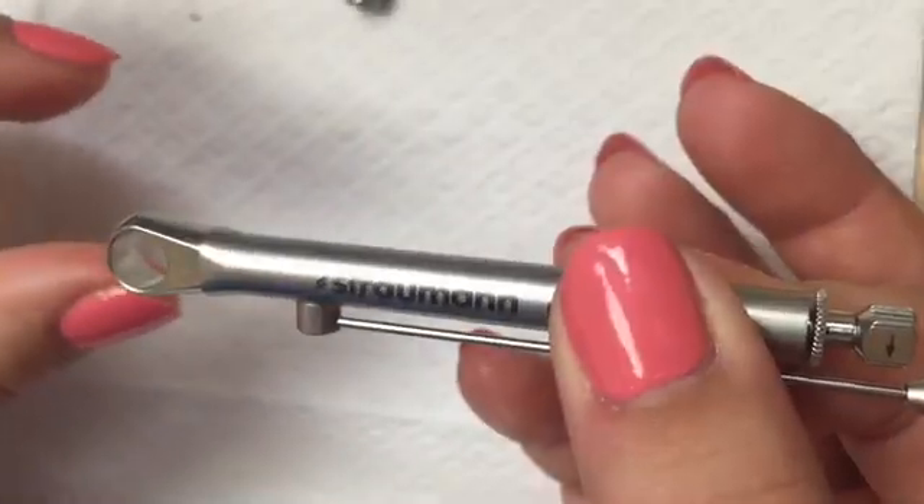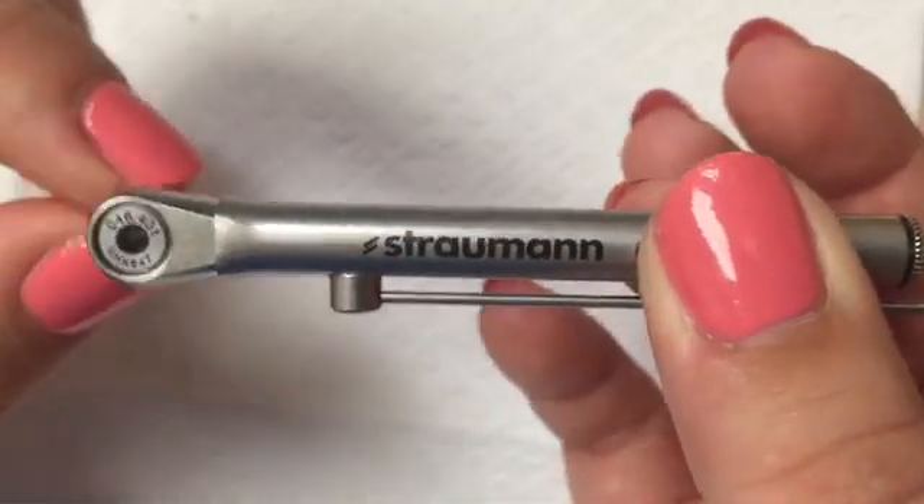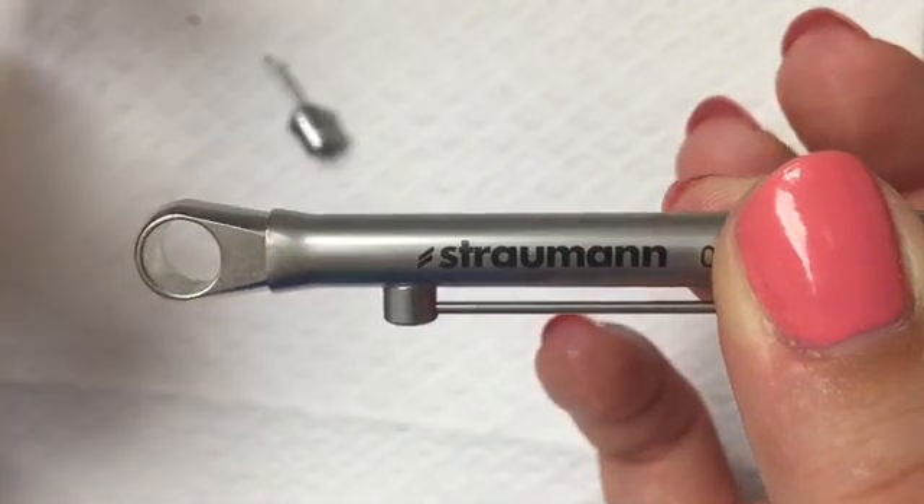Ratchet and torque control device are now assembled and ready for use. If the driver does not attach to the ratchet properly, then the nut on the opposite end must be tightened.